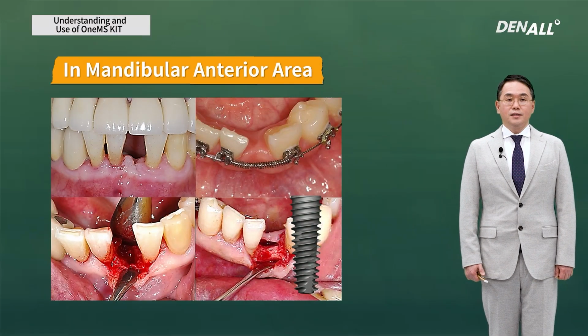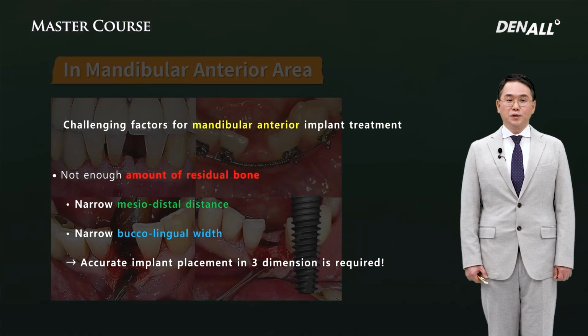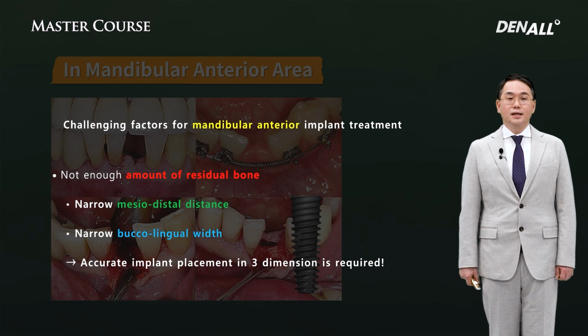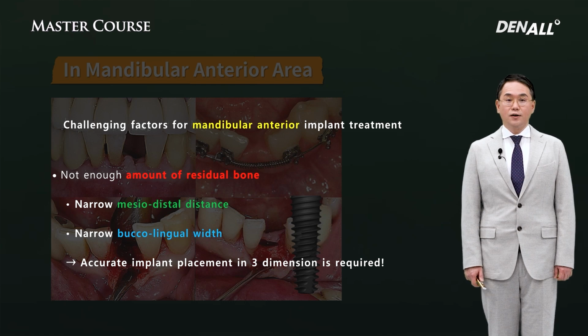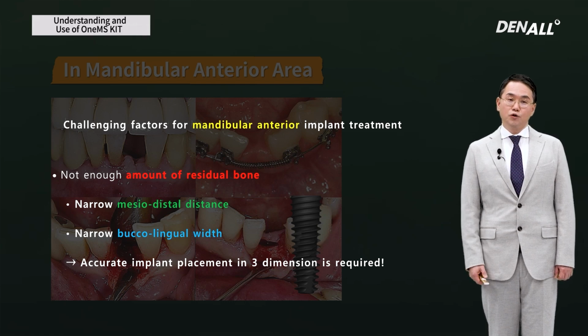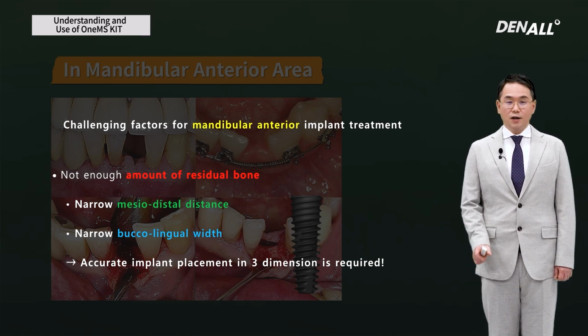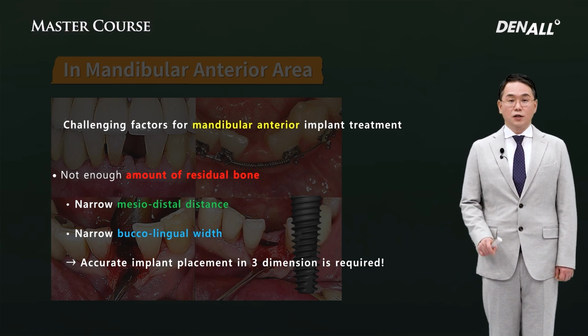When we place an implant in the anterior mandible, we need to consider two factors. One is narrow bone width. The root size is small in that area, so buccolingual width is limited, and after extraction, the width would be reduced further. And the mesial-distal distance in the edentulous area is very narrow, so a normal two-piece type implant cannot be easily placed there. Buccolingual and mesial-distal widths are very limited for placing implants accurately.